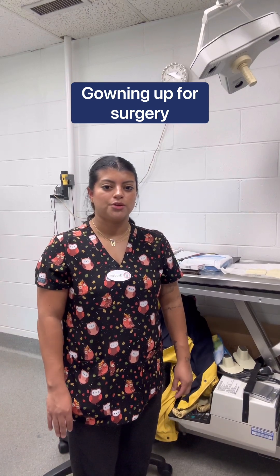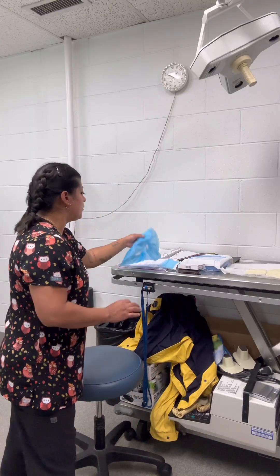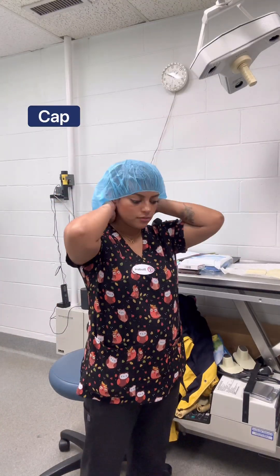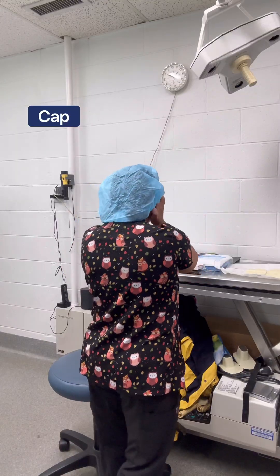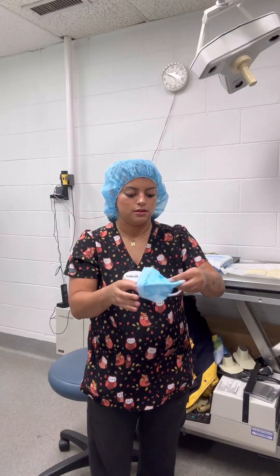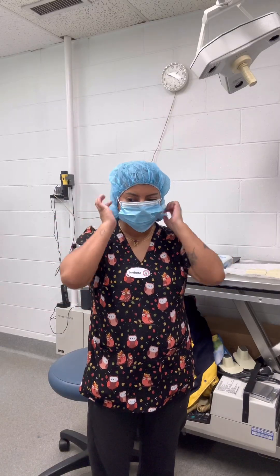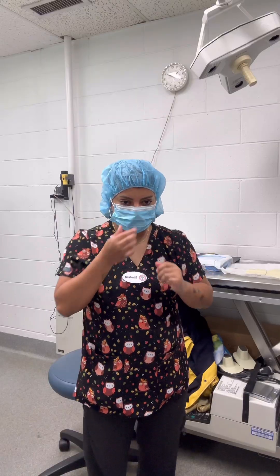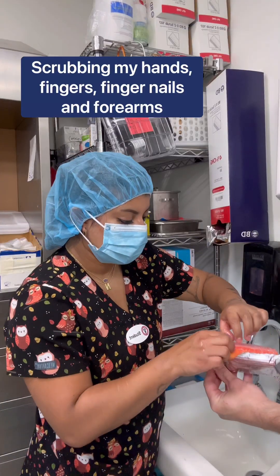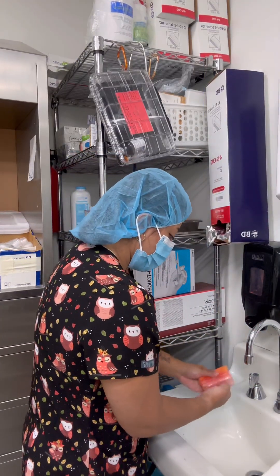In this video, I'm going to be showing how she is dressed for surgery. Alright, we'll just spend some time scrubbing from fingertips to elbows.